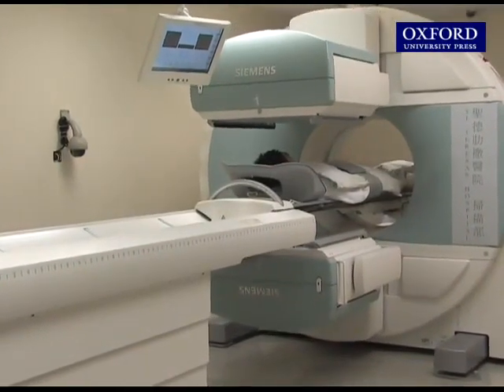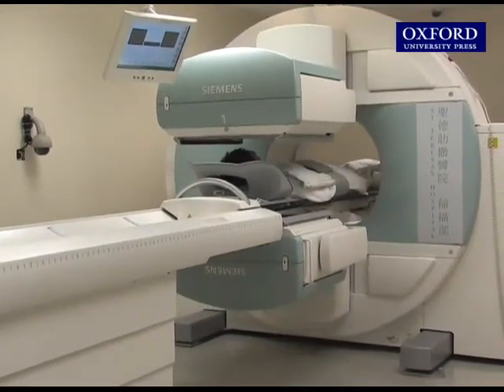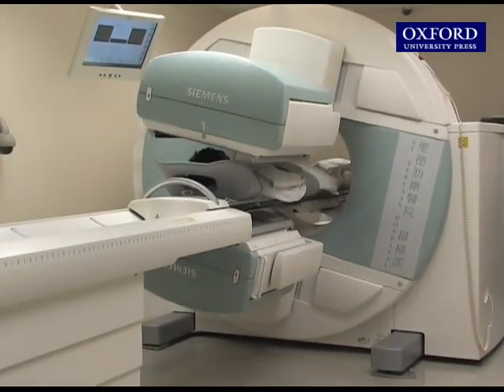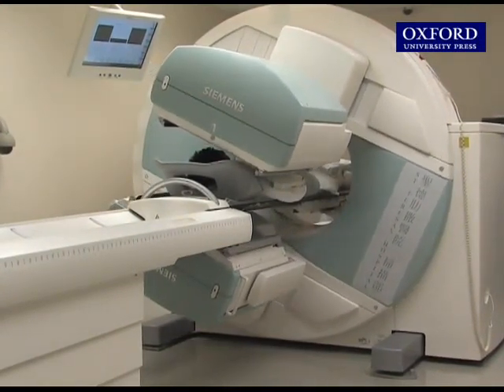During the imaging process, the patient is sent through the gamma camera. The detectors rotate around the patient to collect data.